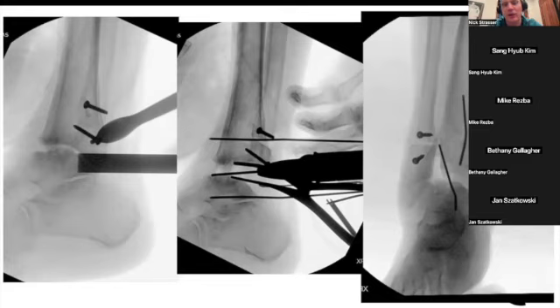I think you see the wires. I was using the K-wire distractor, the Weinraub, or the Hintermann, depending on what you call it. At this point in this picture, I have a lamina spreader in the joint. I use the burr to get all the way down because you can't see much when you're coming from the posterior side. So I did use that percutaneous MIS burr to get in there and help prep the joint from the front.